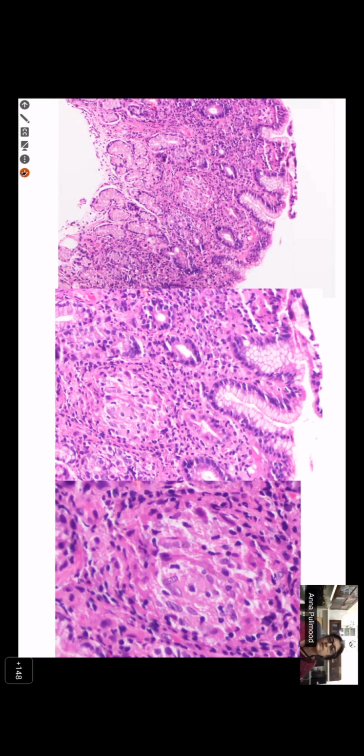Any other comments about this? What else do you have to talk about when you describe a granuloma? What else should you say? Giant cells, ma'am. I can see necrotizing or non-necrotizing. Okay, whether there's necrosis, very good. Caseating, non-caseating. Yeah, that's necrotizing. Caseation is a better word when you're thinking of TB. So what's your differential diagnosis at this stage?